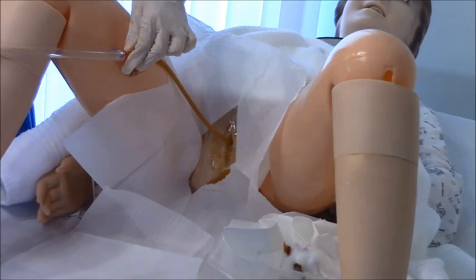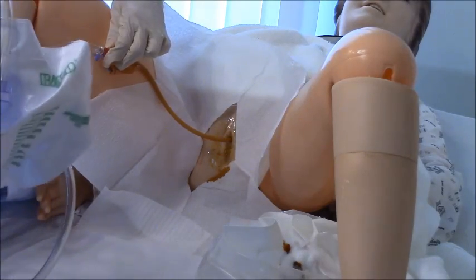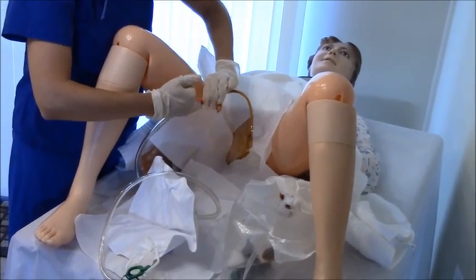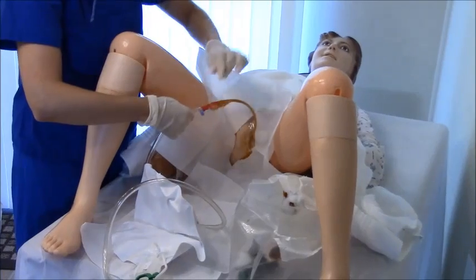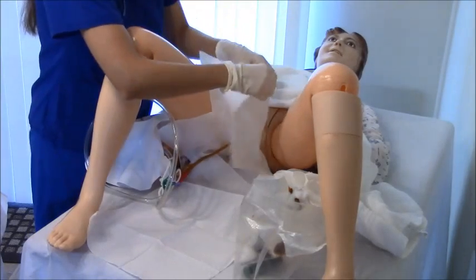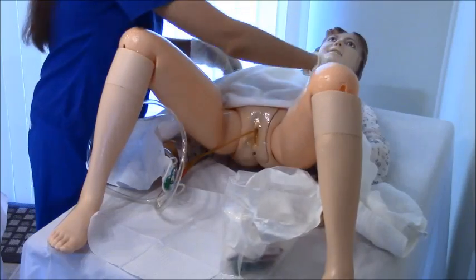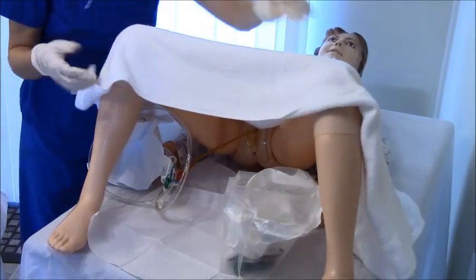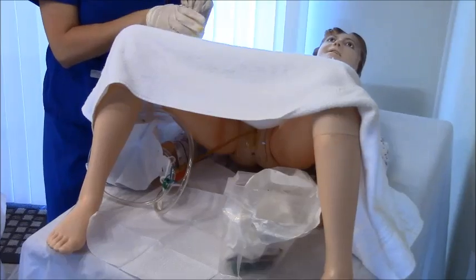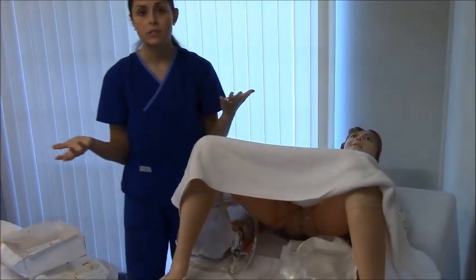Connect the Foley catheter down to the collection bag at the bed, which is where the urine will collect. If a specimen is needed, use a syringe at the specimen port to withdraw urine. After that, connect the bag to the bed, get your patient uncovered and reposition them, keep them covered, and make them feel comfortable. Ask the patient if there is any pain or discomfort — their response will tell you whether the catheter is properly placed. Then remove your gloves and perform hand hygiene.